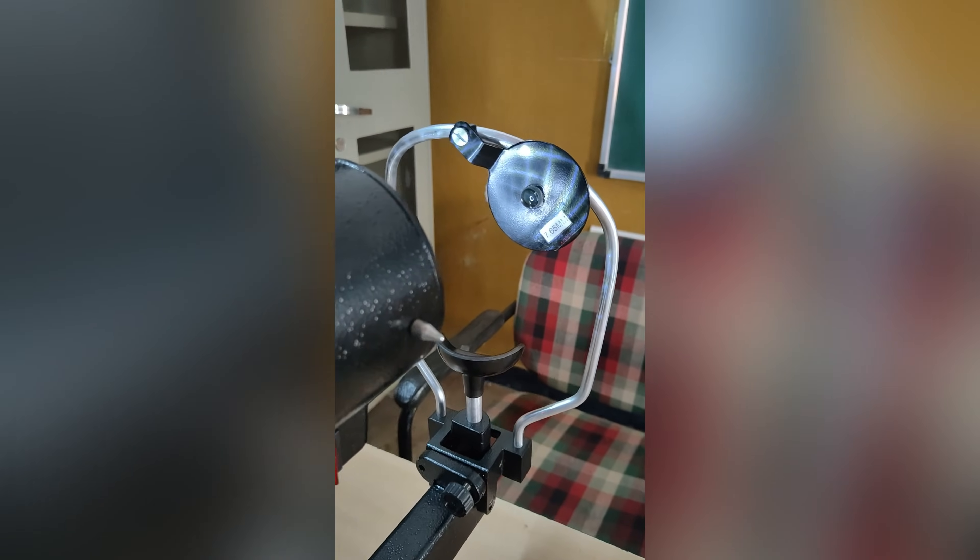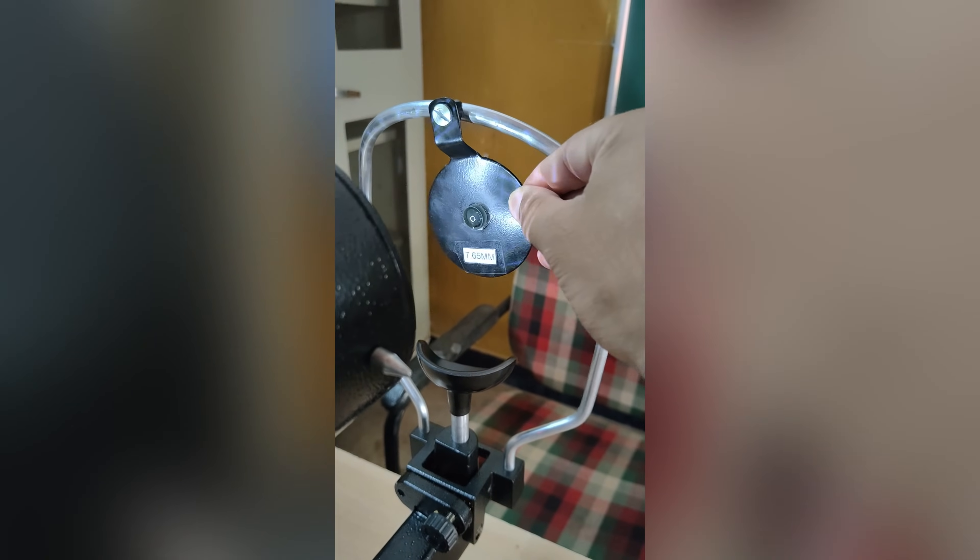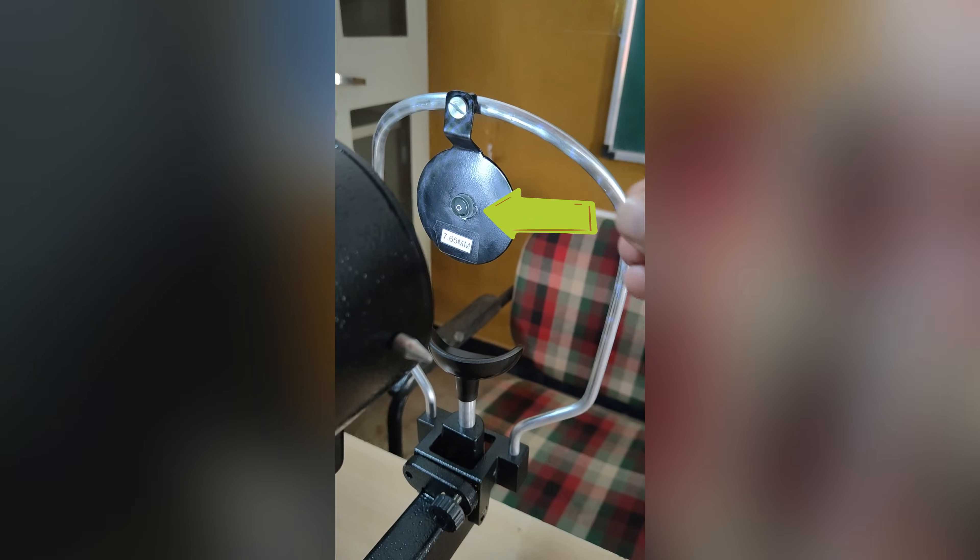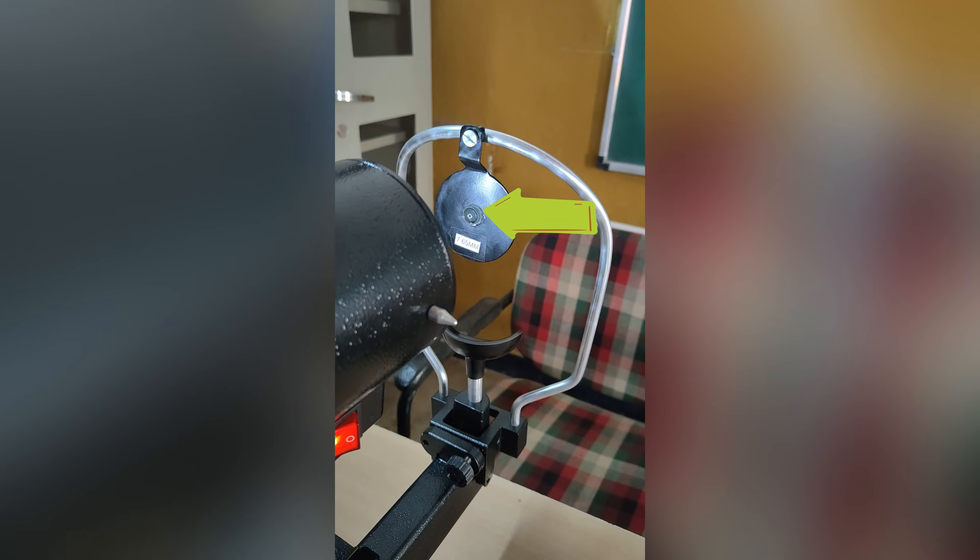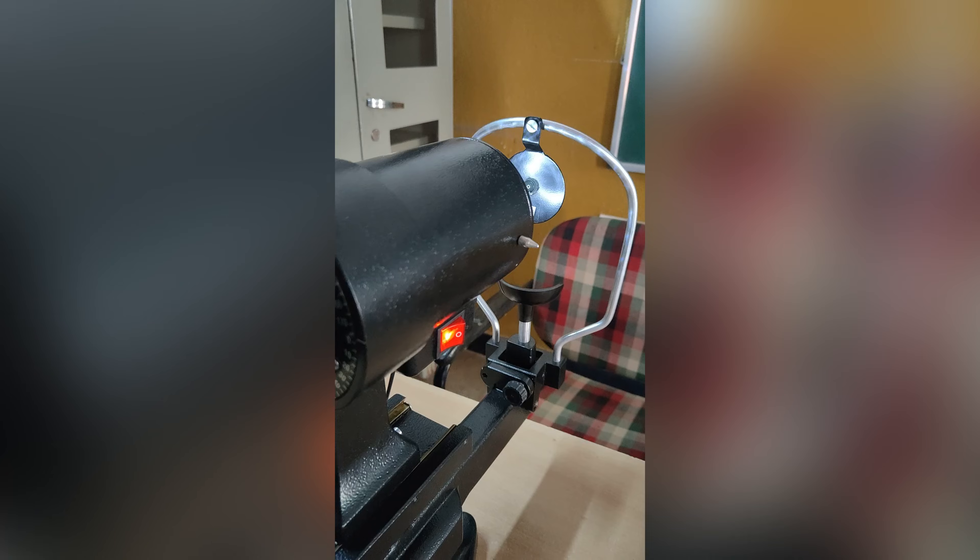Second, make sure that keratometer is giving correct results. A steel ball of known parameter is placed in front of keratometer. In our case, we are using 7.65mm.